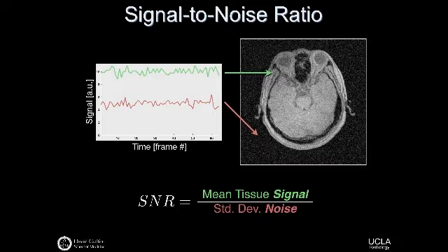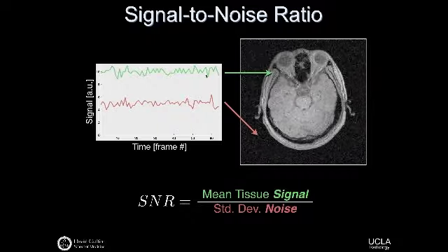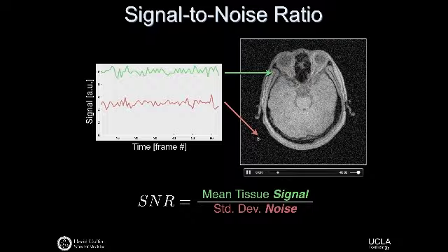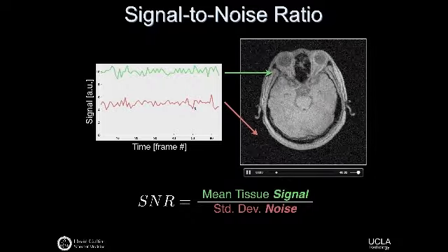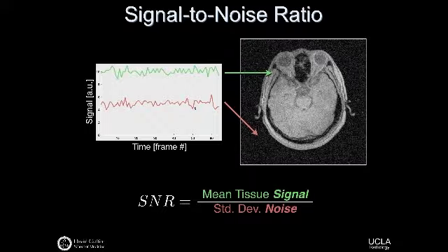And so this is supposed to be a movie. If I acquired this axial slice hundreds of times, and I point to a single pixel, that single pixel will have some oscillations as a function of time because there's noise in my image. I can point to a background signal as well, and it will also fluctuate over time and be lower in amplitude because it's in a background where there's no signal and effectively just noise.